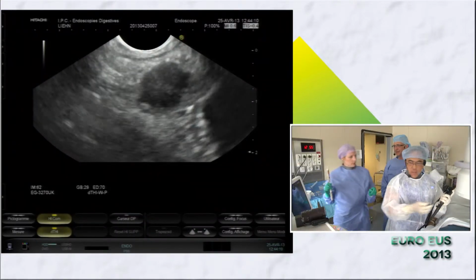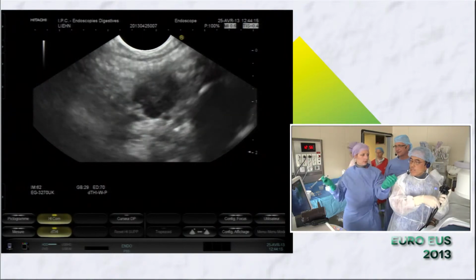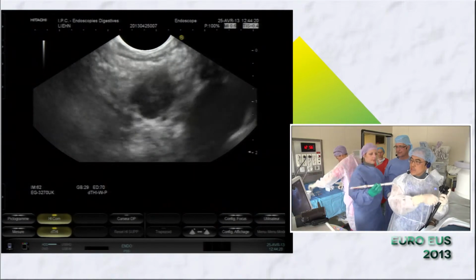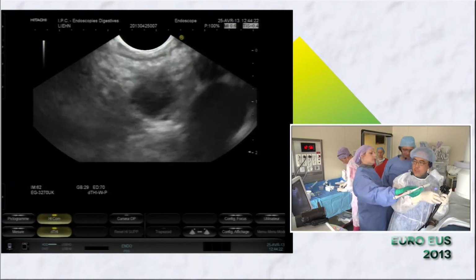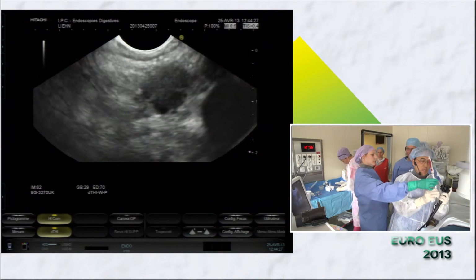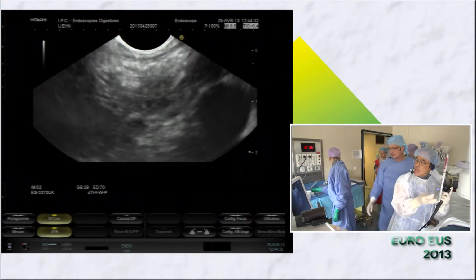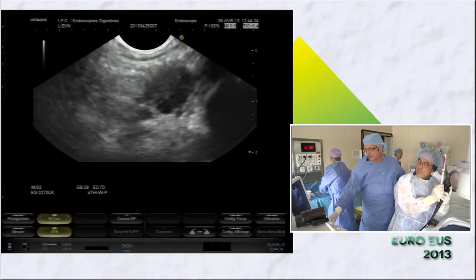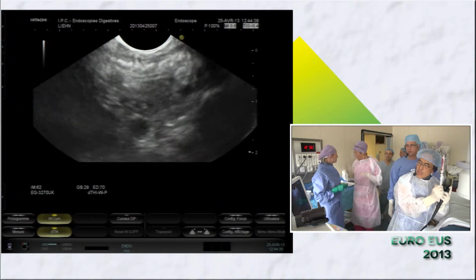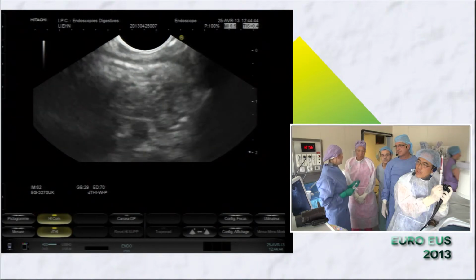So I'm going to demonstrate with the 25 Procore. We're going to use no suction. We're just going to use the stylet slow pull. And then for the needle part, I like to use very rapid to and fro, something I call the lock jam technique. I'll show you that as well.